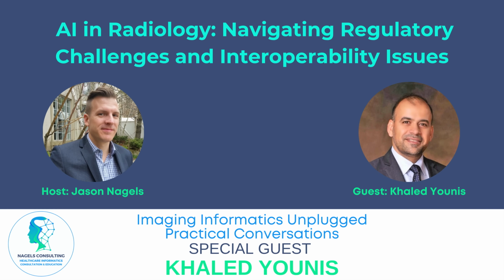And the different digitizers have different properties. So when you look at the grayscale on the digitized mammogram, you will find that it's different depending on the actual digitizer. So the same optical density can have effects, of course, on the algorithms, the features that you were using to detect.